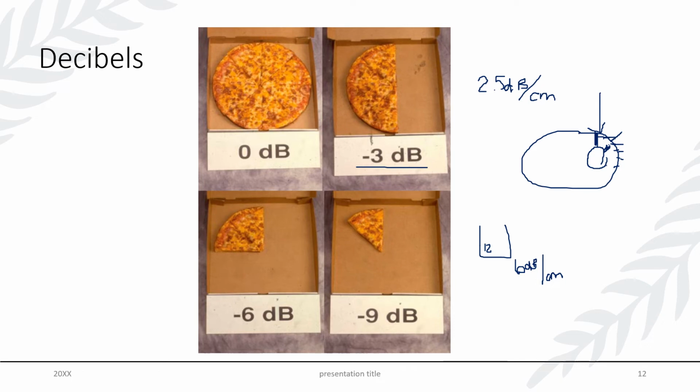So those kinds of basic understandings can really drive your scanning practice to make you able to operate better and accomplish more with the technology that we have. The other thing is that it's really just a representation of how important it is to utilize the appropriate frequency for what you're trying to do. Higher frequency has reduced penetration, so if you can't get to the item, it's just not going to work. You're going to have to give up that resolution to at least get an image of the item or the anatomy.